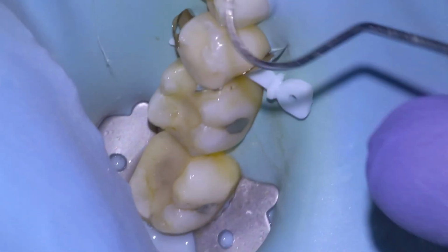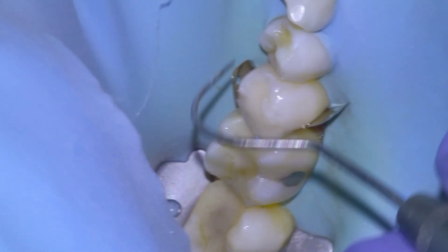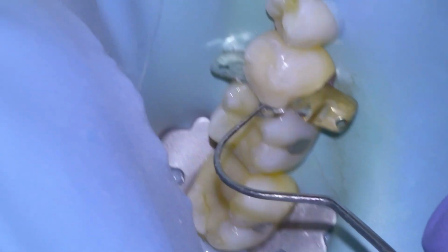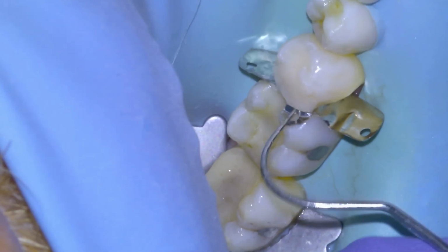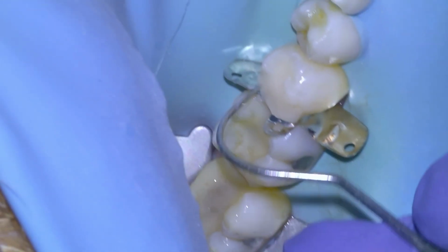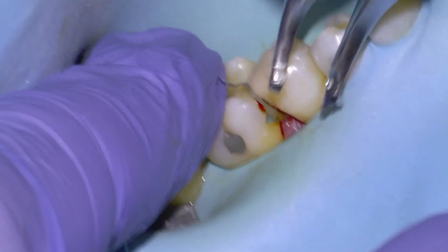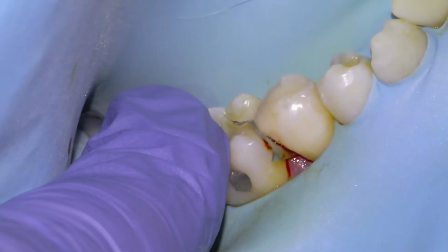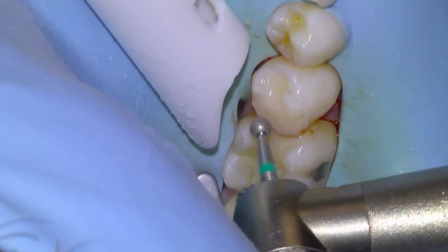So we'll come back, disassemble the matrix assembly, remove the wedge and the band, and sometimes these can be difficult, so I'll usually take an explorer and separate the occlusal portion, and then I'll use a Howe plier to tug a fin of it. Careful that it doesn't come flinging up and you bash the upper teeth. This one actually broke on us, but we have a little piece that we can grab, so we'll do that, and now we can get to finishing the filling.